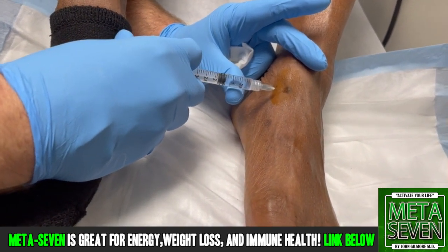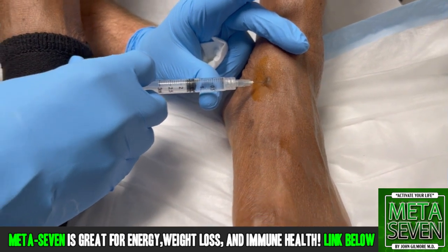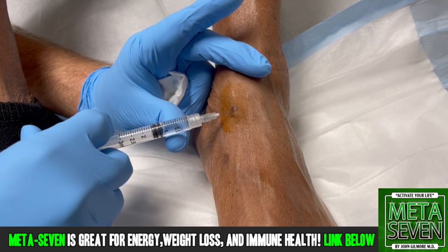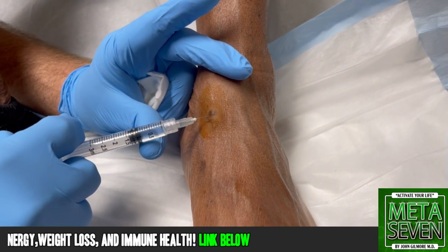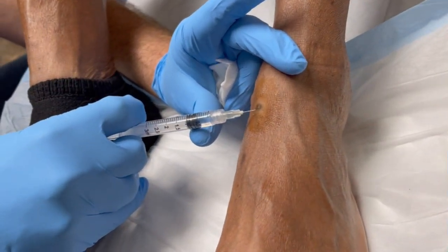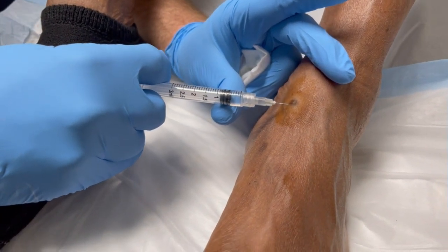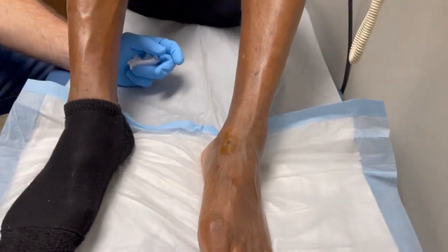So this is a house blend lidocaine. We're using a small — it's got epinephrine in there. Epi helps us with local vasoconstriction and gives us less bleeding. Stinging a little bit? Not now. It did sting at the beginning of it, didn't it? Yeah, very good. All right.